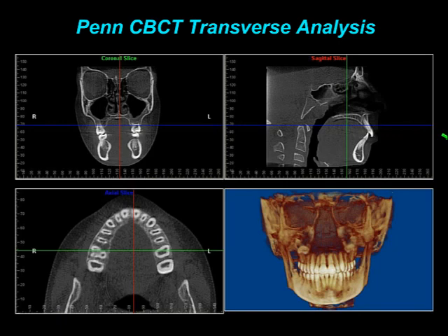When we came to determine what this relationship is, we took cases that were like this. Now this was an untreated case that when we looked at the cross sections, we can see that both the maxillary and mandibular teeth are upright, centered, and well intercuspated. So that's why we wanted to determine, well, in these cases, when they look normal and they appear to meet the goals that we're trying to shoot for, what is the relationship between the upper and the lower jaw?